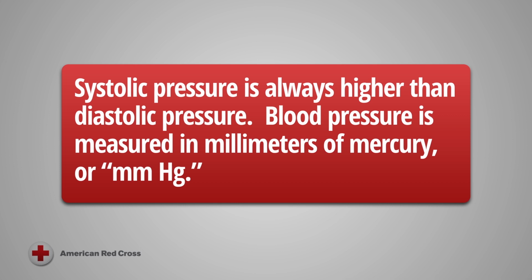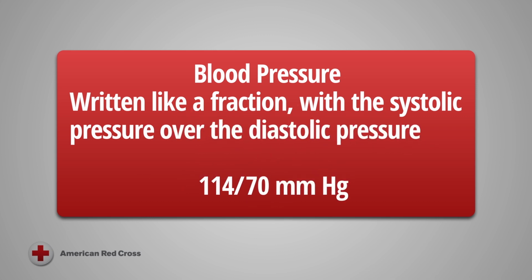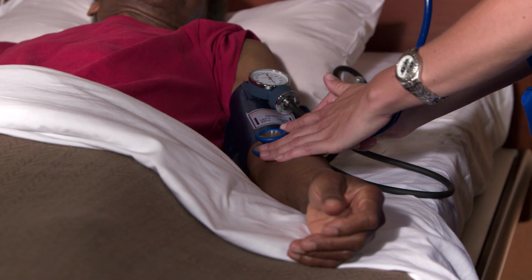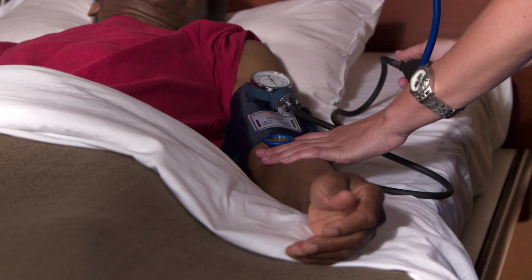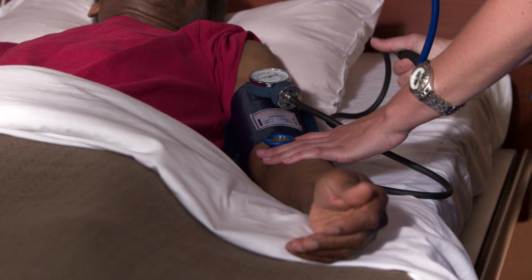Blood pressure is measured in millimeters of mercury, or mmHg. A blood pressure reading is written like a fraction, with the systolic pressure over the diastolic pressure. It is normal for the blood pressure to vary throughout the day, within a relatively narrow range. Be aware of the range of blood pressures that are considered normal for each of the people in your care.